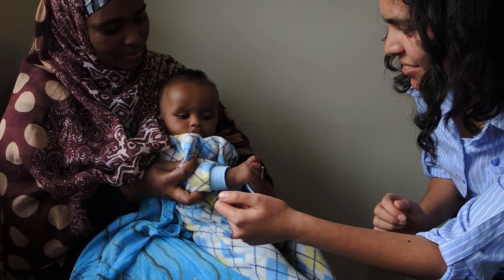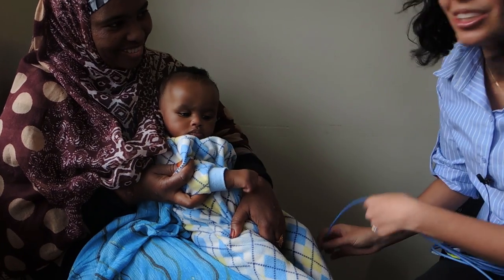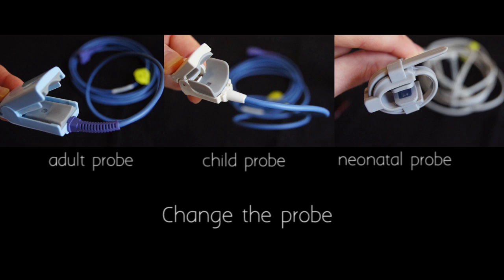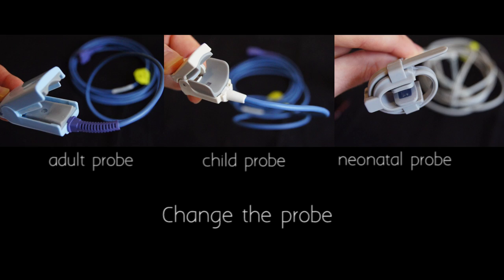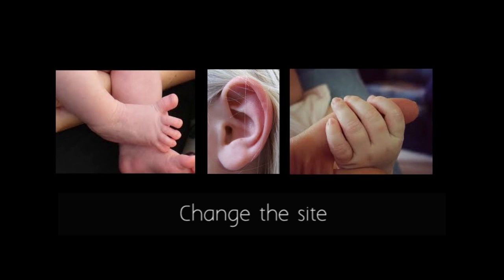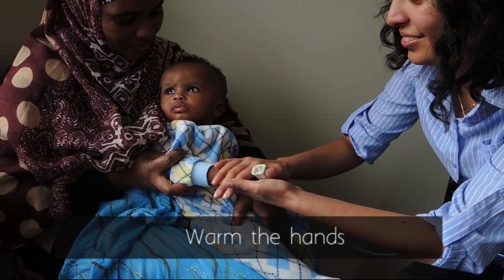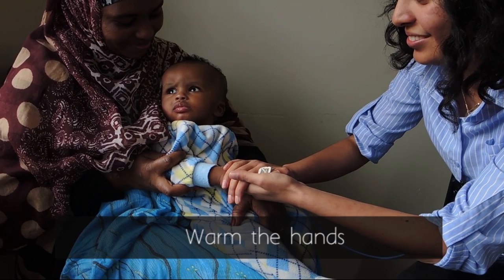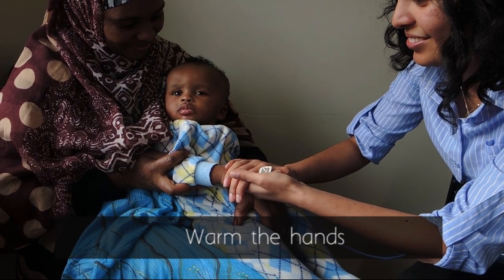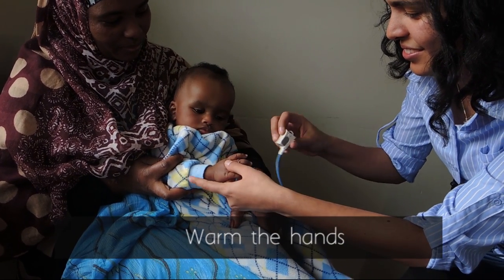It can be difficult to get a good reading if an oximeter probe is poorly fitted. Try a different size probe or move the probe to a different finger or toe. Make sure the hands and feet are warm — if they are cold, blood flow will be limited, causing the pulse signal to be weak.